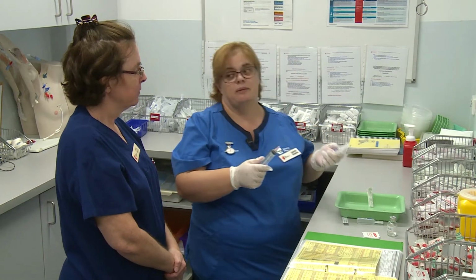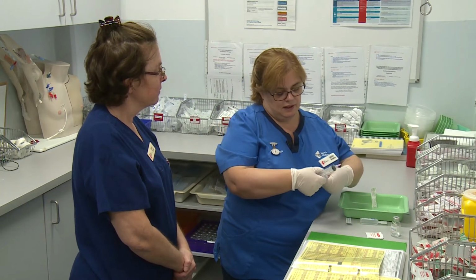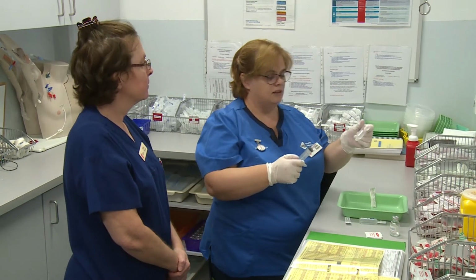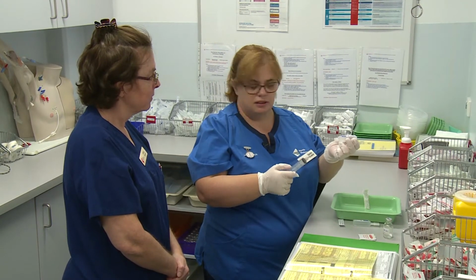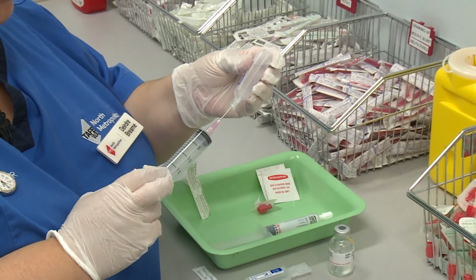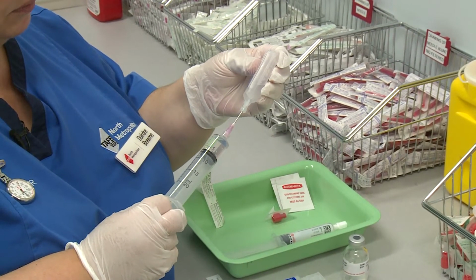And you will get better at this. I don't know if you do this very often, Jerry, but you will get better at doing this and be able to do things without contaminating. Okay, so I've taken the lid off, made sure that I didn't touch that with my needle. So now I'm just going to draw up, making sure I don't touch that needle at all. I'm going to draw up my 10 mils.